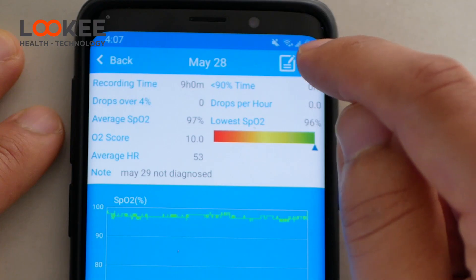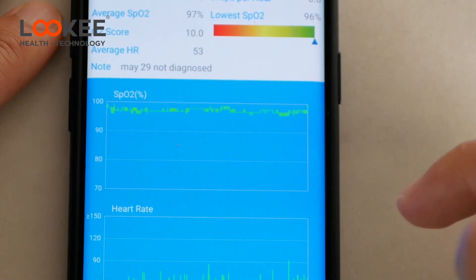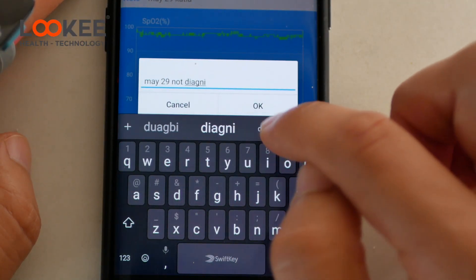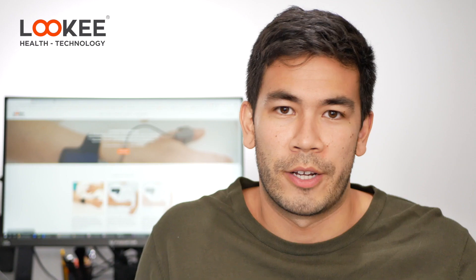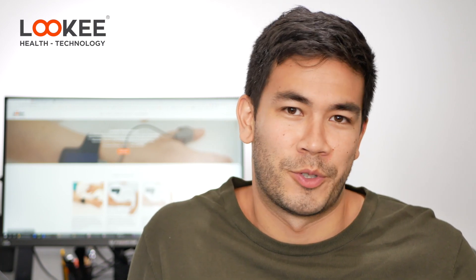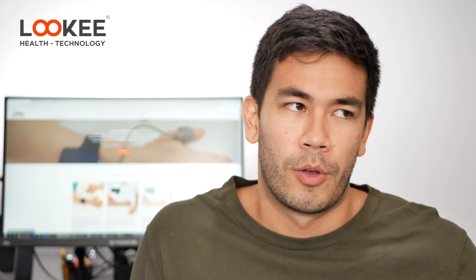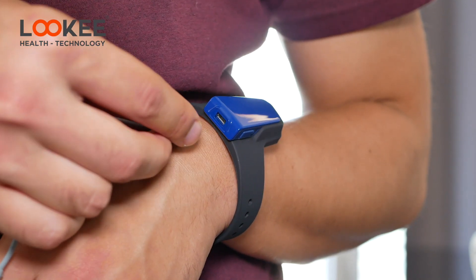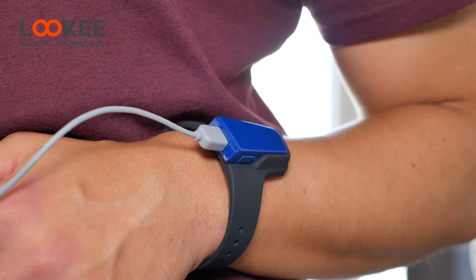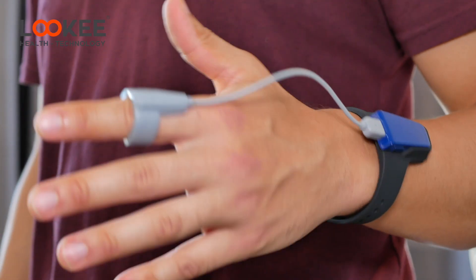Another really cool software feature is the ability to share or export your results and annotate your reports. If you had a bad night, you can write a note, then look back at your historical logs and see, for example, that your blood oxygen saturation dropped and note the reason — maybe you were drinking that night. This is very helpful for historically monitoring how well you've been receiving your CPAP therapy or just how well you're sleeping in general.